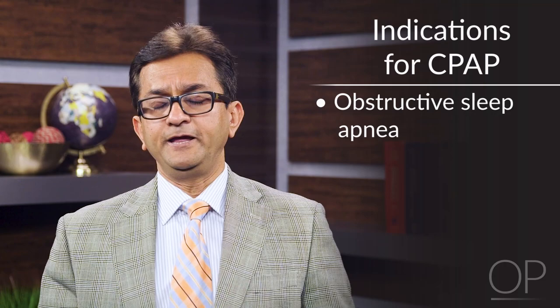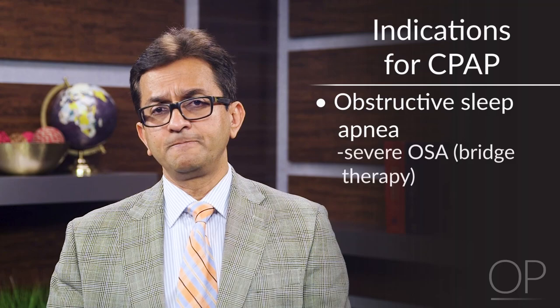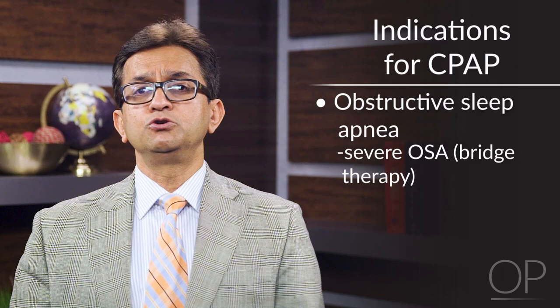The most common indication is obstructive sleep apnea. Typically, when a child has severe obstructive sleep apnea, we use this as a bridge therapy until a more definitive intervention such as surgery is done. Or sometimes we use CPAP when there is no surgically treatable lesion for that patient.